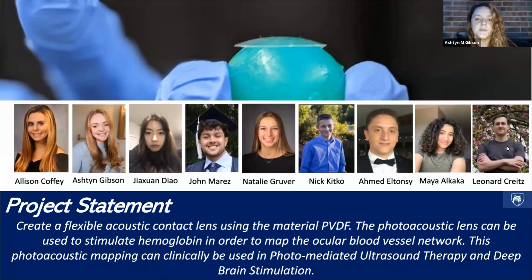The flexible acoustic contact lens's capstone goal was to target the large market for non-invasive ocular therapy, given the amount of people with visual impairments. To do so, we researched flexible miniaturized transducer devices to put into a contact lens made of PVDF due to their ability to conform to complex shape geometry such as the eyeball.